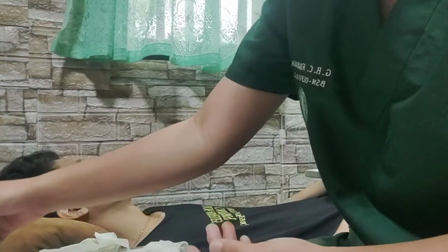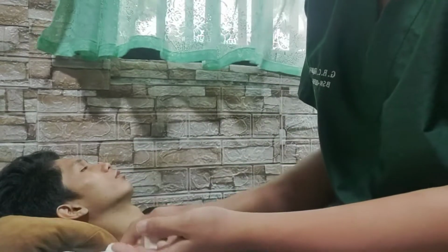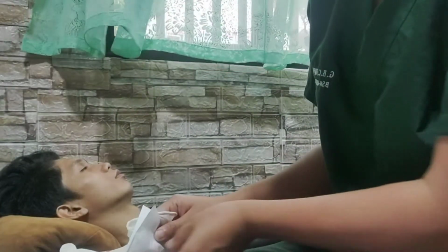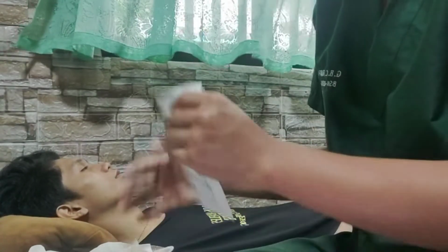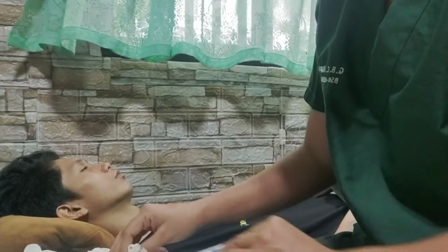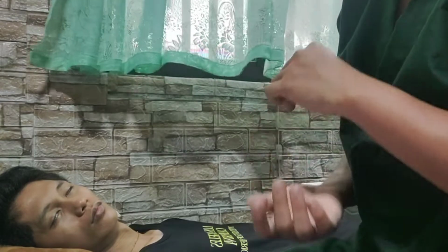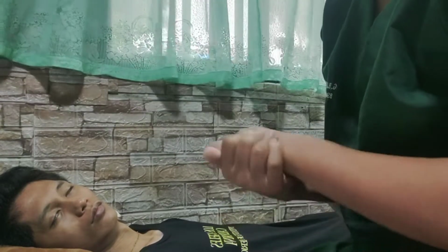Next, the kidney basin, gloves, clean cloth, and sterile OS. So let's start. So first, we need to wear gloves to start the procedure.